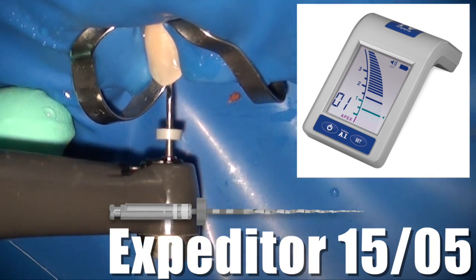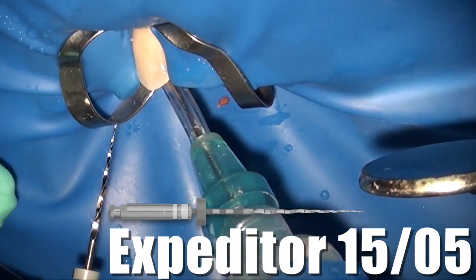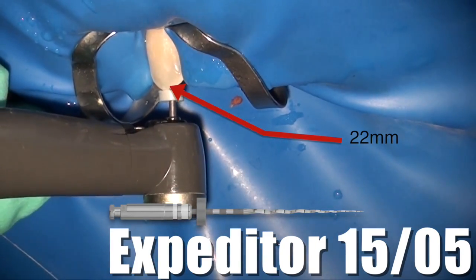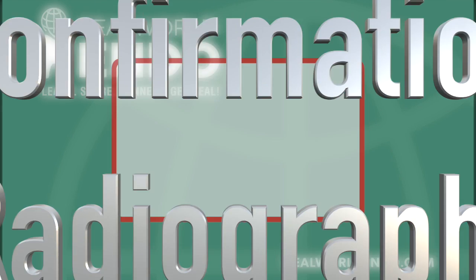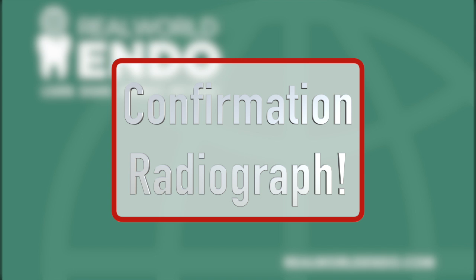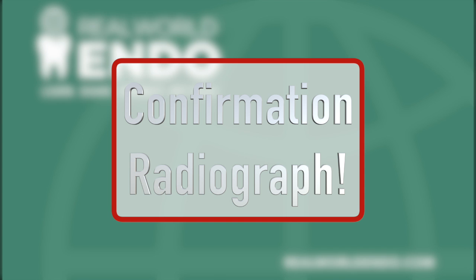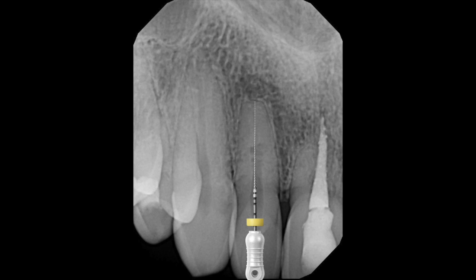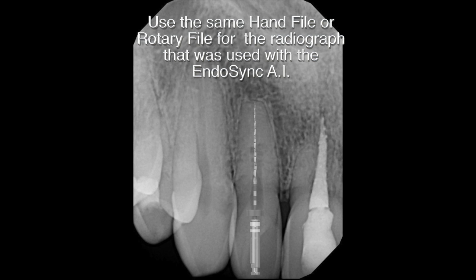A few millimeters short of the apex there's a slight ledge caused by the resorptive lesion. I normally repeat this process once or twice to confirm we come to a stop at a consistent point indicating we've reached the apex. We then proceed to a confirmation radiograph to verify the apex locator reading — apex locators are very accurate, but a confirmation radiograph is always helpful. You can use either the hand file or the rotary expediter for your confirmation x-ray.